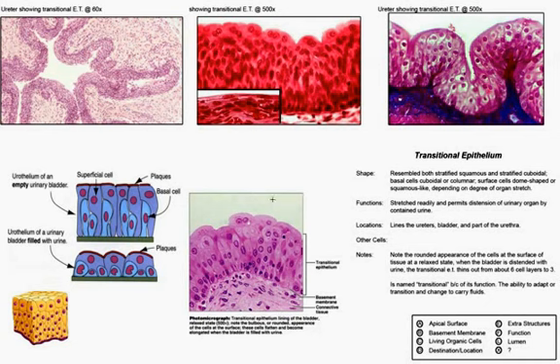squamous type appearance. You can see a nice view of the basement membrane here, and then approximately 4 or 5 layers of anywhere from cuboidal to columnar type cells that then become squamous in a distended bladder like we see here. It's just difficult to show a full bladder on a slide if you want to keep things dry. Alright, so that's transitional. One more time, it transitions from a cuboidal or columnar appearance to a flattened, plaque-like appearance of flattened cells that looks like this, and a protective, distended or stretched wall of the bladder when it's full.